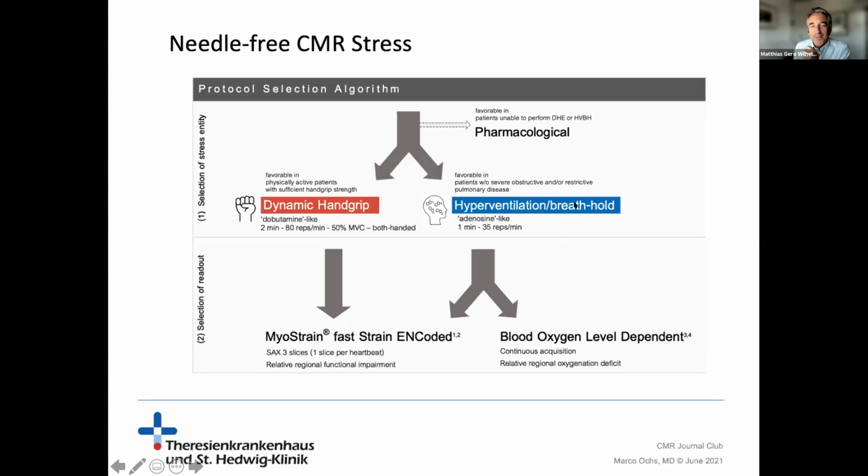Do you think strain rates could add sensitivity to the detection of myocardial ischemia? So strain rates instead of just looking at strain? I cannot answer that. Maybe, yeah. Okay. That's something to explore. We don't have the data, it could be, although the temporal resolution requirements for strain rate are even stronger than for just strain. But it's certainly, again, a good question and an interesting avenue.